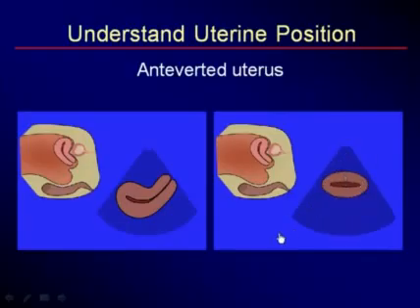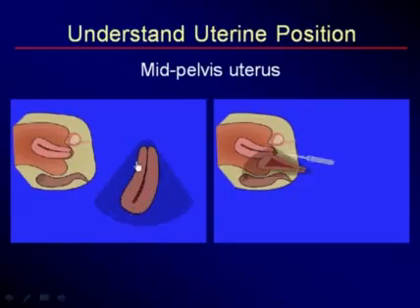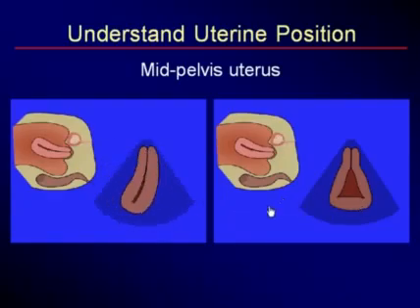The uterus has somewhat of a donut shape, has an endometrium located centrally. Now look at this uterus. It's a mid-position uterus. Here, it points down. It's parallel to our beam. And when we turn 90 degrees, we actually get a true coronal frontal cut of the uterus. So this is a mid-position uterus. Nowhere near does it look like the anteverted uterus.